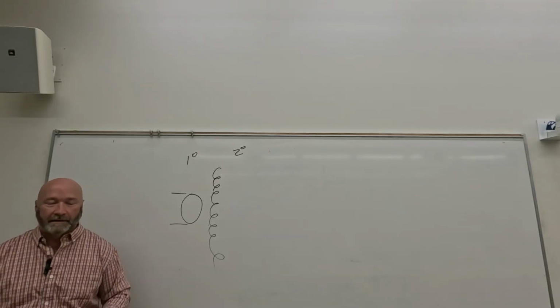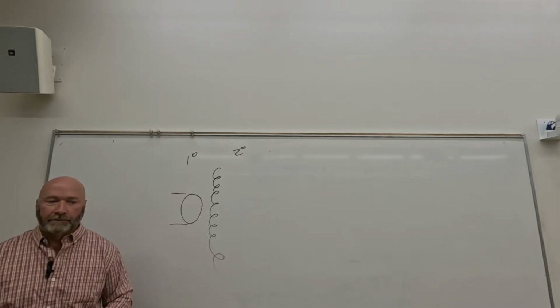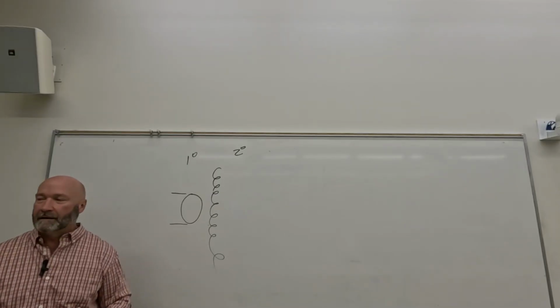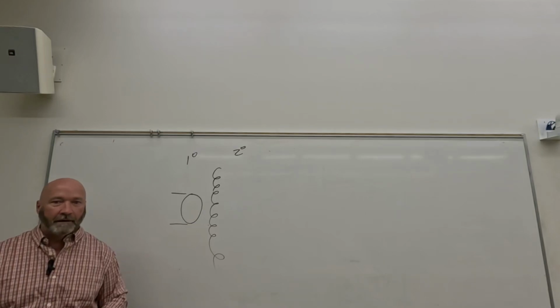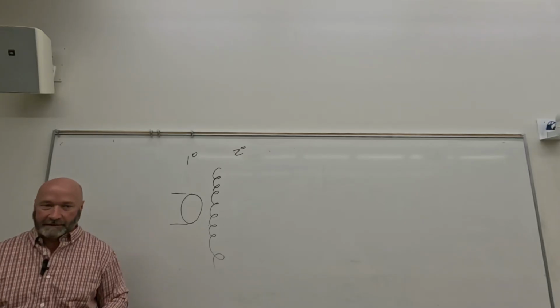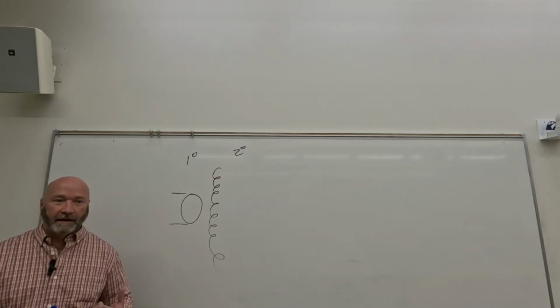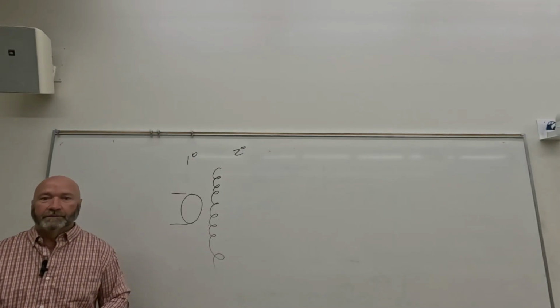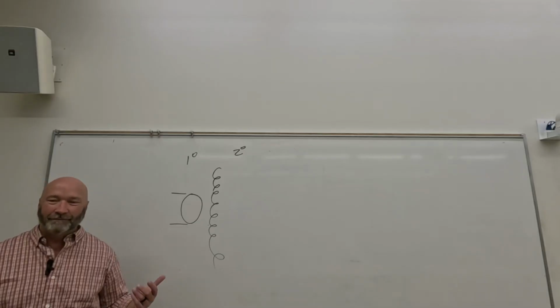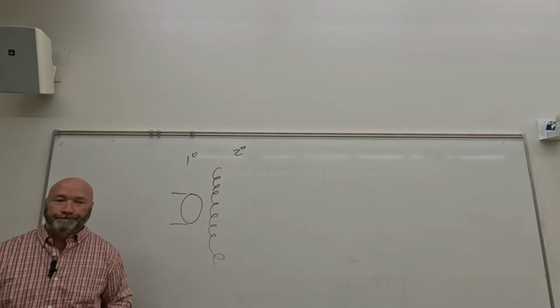Well, the same thing happens in the hospital. Power companies supply us with that electricity, 110, 220 volts, and if they don't have a good way of monitoring that and adjusting for it, then the same thing would happen in a hospital. So imagine all the stuff that's plugged in at the hospital. You have CT, MRI, you've got monitors, you've got beds that raise and lower, you've got massive air conditioners and heaters, right? So the voltage that's coming into the hospital may fluctuate by 5 to 10 volts. And then you add in all that stuff, and it can really fluctuate.